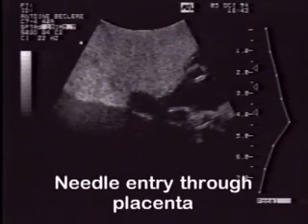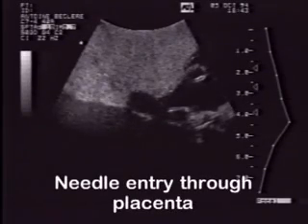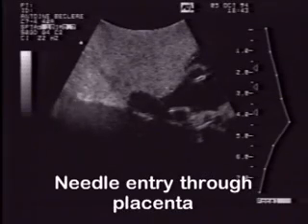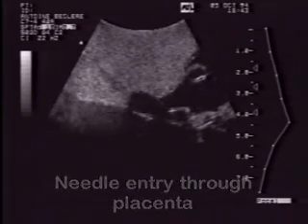The needle passes through the placenta and reaches the foetal cord.